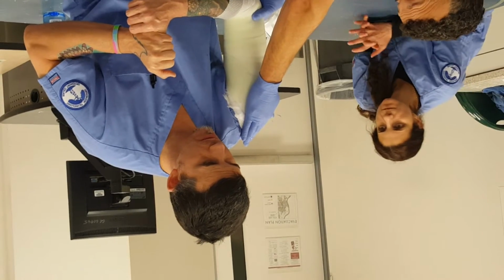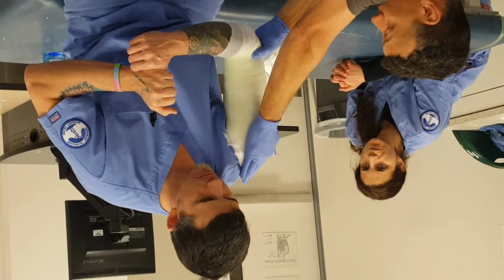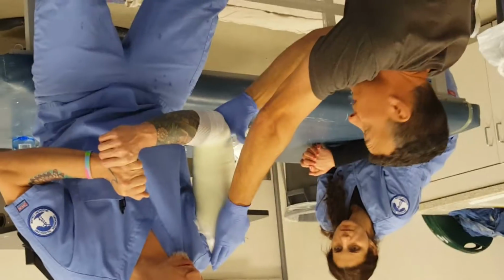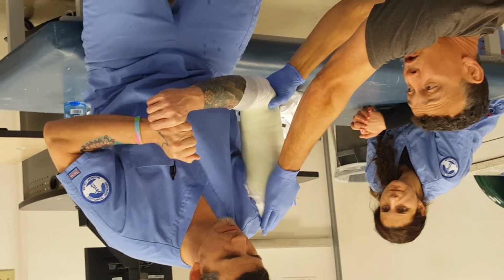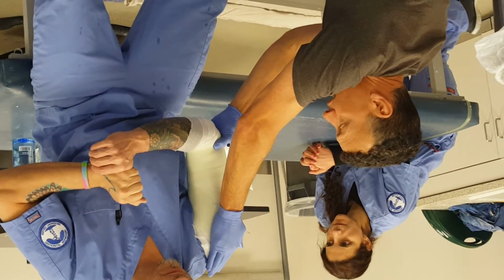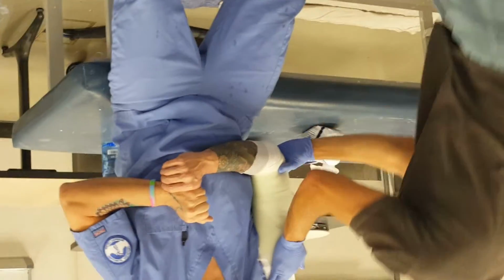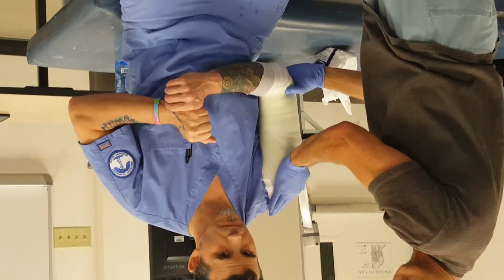Now, if this was up to me and I had to have a humeral fracture brace, this is way better. Those fracture braces, people hate them. They get loose. They constantly have to be adjusted. They're non-forgiving. It's micro foam that's up against the skin or close to the skin. All you have is a piece of stockinette. Now, granted, now that I have this on, he can straighten up. I just put it next to his body. This has to have a collar and cuff on it too.